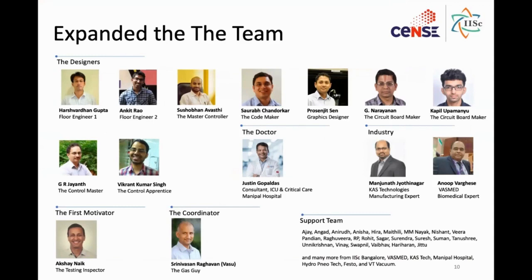So we had to understand what it takes. So we got people like Anup, who runs a medical company. He actually told us, look, these are the certifications. This is how you design for failure. This is how you design for safety. We had to get people from electrical engineering who told us how to run a good control system, so that you don't cause a pressure spike that can kill a patient. We got electronics engineers from the electrical department who actually made professional-looking PCB boards that don't look like an octopus, but actually look like a system.